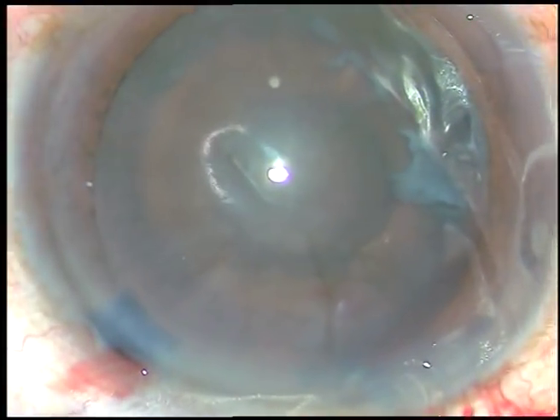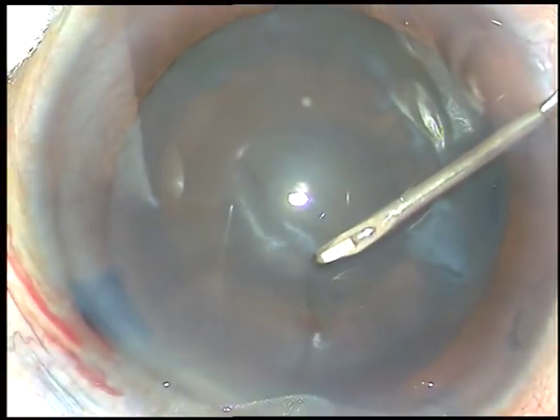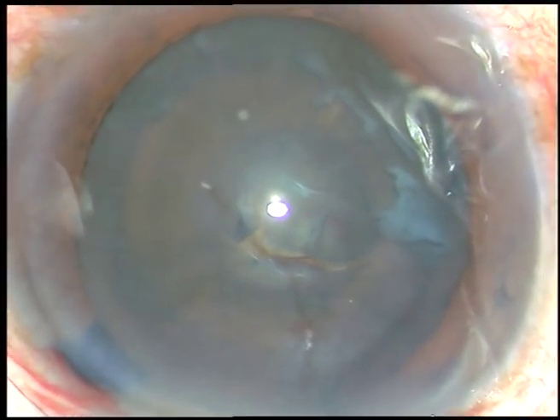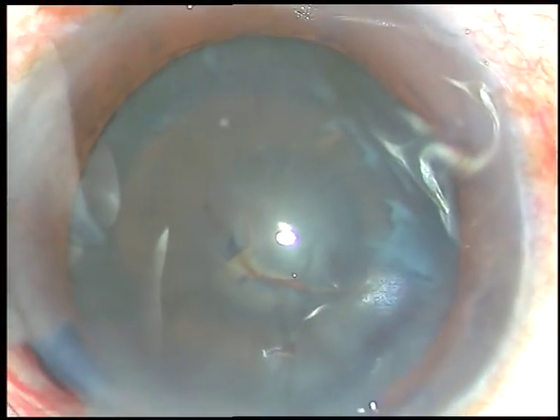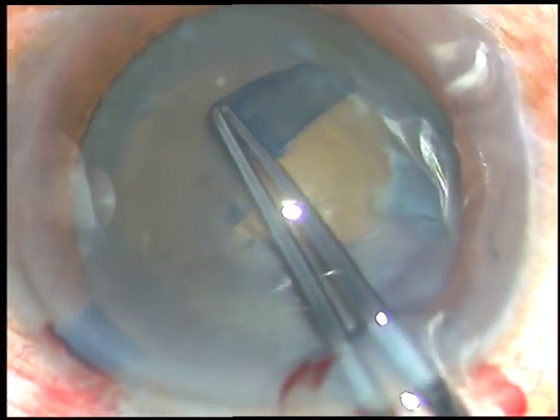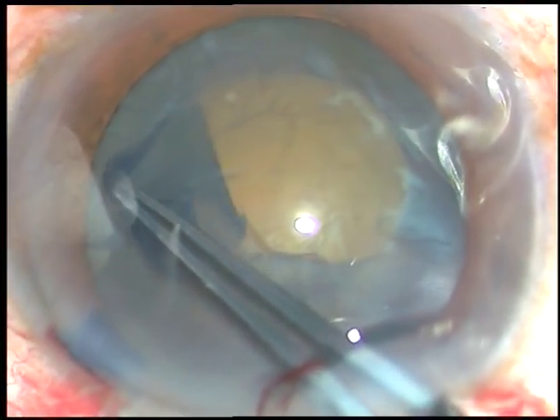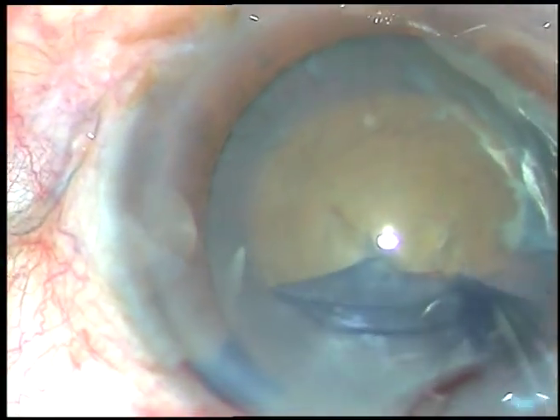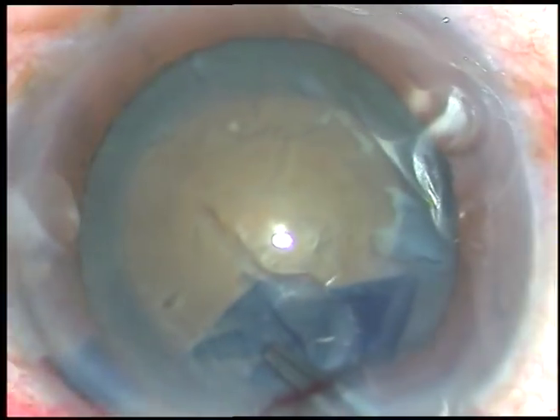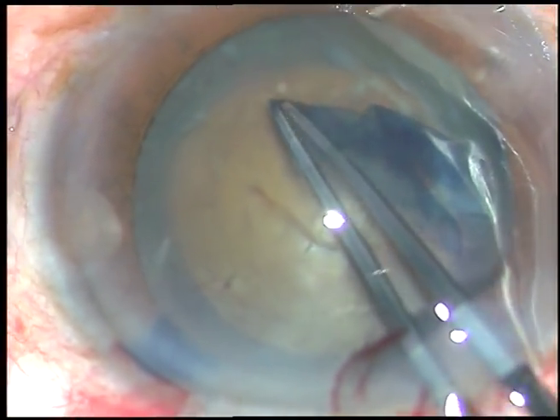See how it is being done. I incise the capsule with a 26-gauge needle and raise this flap. Now I take a unit of forceps, hold this flap, go anticlockwise. I try to remain at equal distance all around from the margin of the dilated pupil, and thus I do this rhexis.